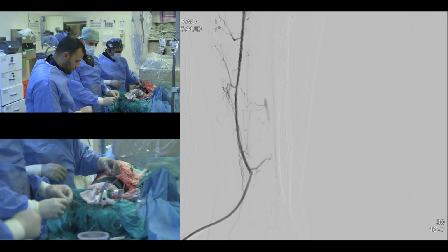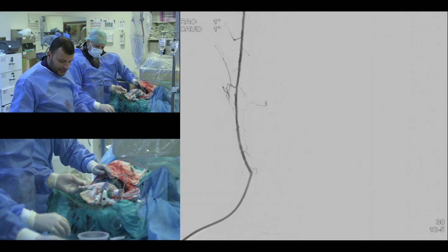Again, no calcification, you follow that route. If you have heavy calcification, you follow that route.